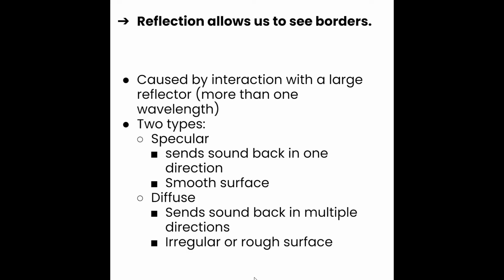Both scattering and reflection do divert some of that sound energy, causing attenuation, but both concepts are imperative to being able to create echoes that return to the transducer so we can create our ultrasound images. So we're actually going to cover both scattering and reflection again in much more detail in Unit 6B.